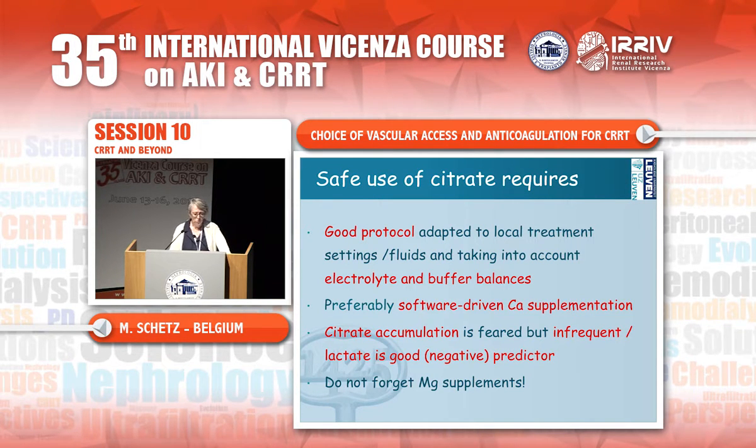So in conclusion, the safe use of citrate really requires a good protocol, taking into account all electrolyte and buffer balances, preferably with software-driven calcium supplementation. Citrate accumulation is a feared complication, but it is rather infrequent, and lactate appears to be a good, mainly negative, predictor. And finally, since citrate also binds magnesium, don't forget the magnesium supplements.